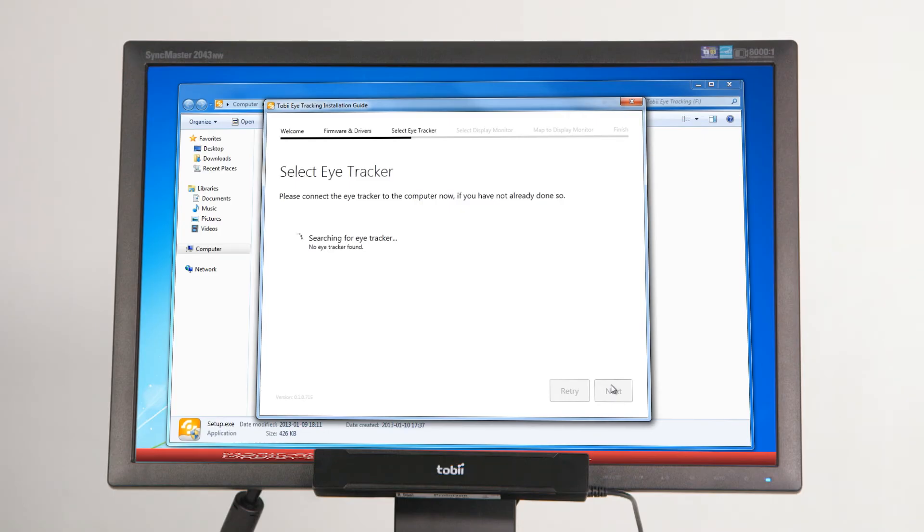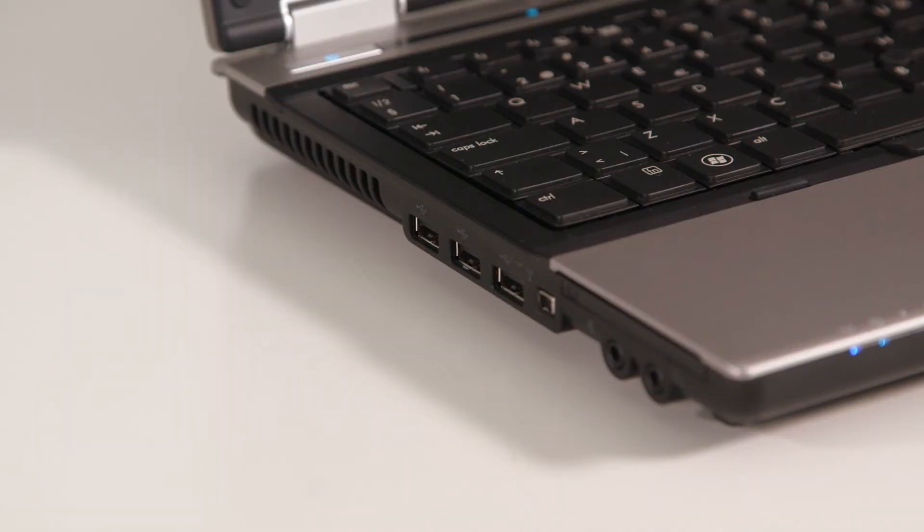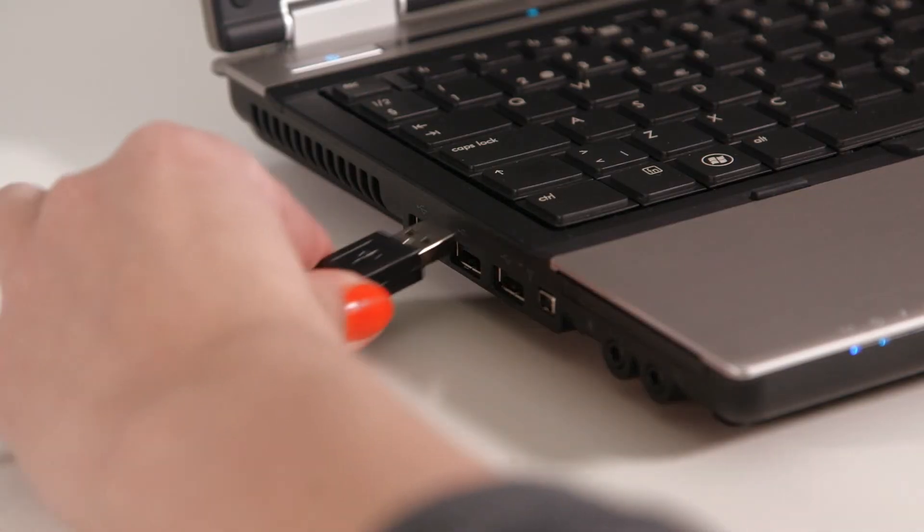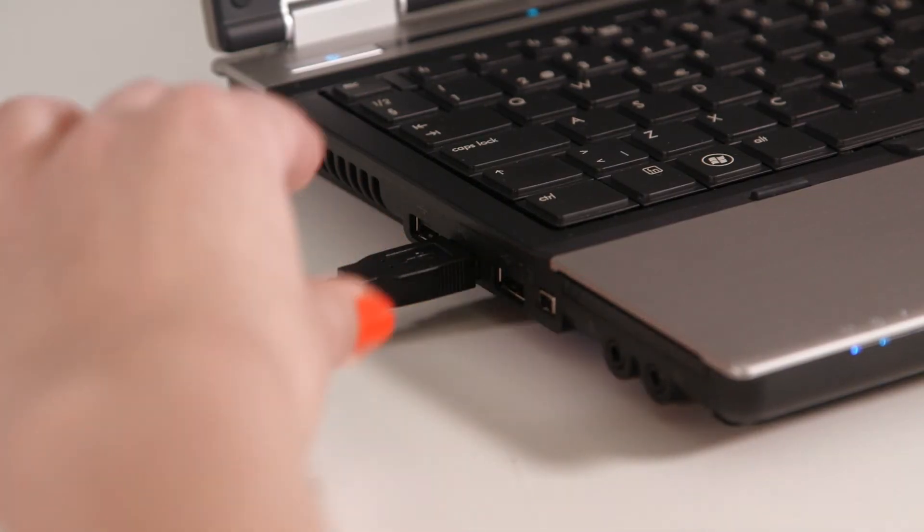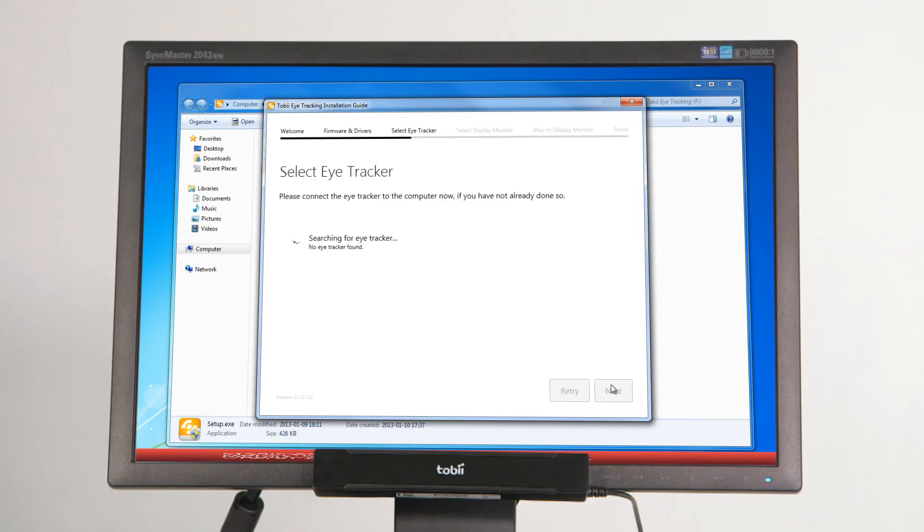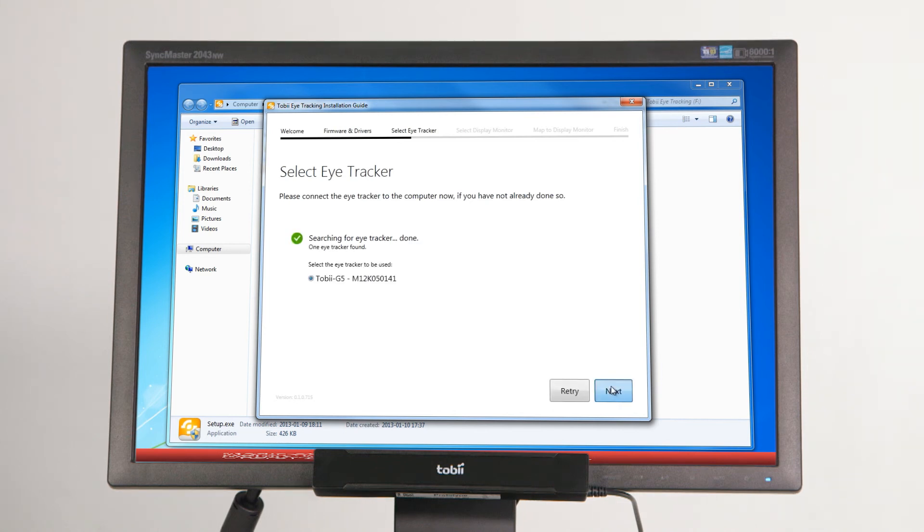If you have a Tobii X2 eye tracker without an external processing unit, connect the USB connector of the eye tracker to the computer. Once the eye tracker has been connected and detected by the system, you can proceed to the next step.